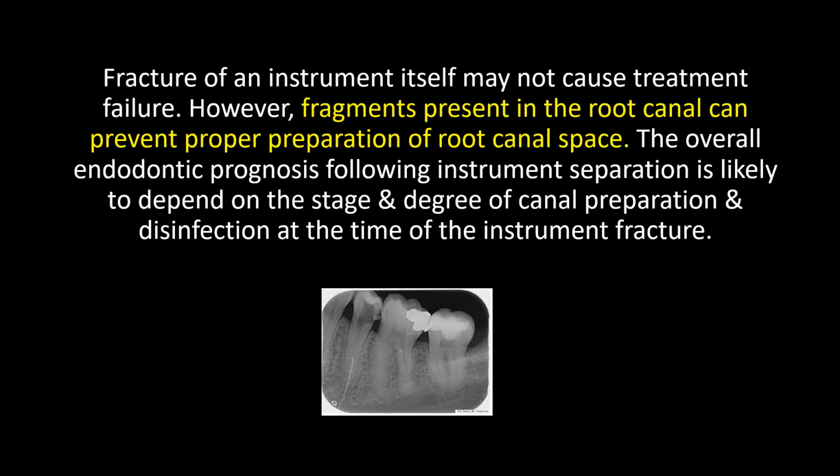Broken file retrieval, part 2. Fracture of an instrument itself may not cause treatment failure. However, fragments present in the root canal can prevent proper preparation of the root canal space. The overall endodontic prognosis following instrument separation is likely to depend on the stage and degree of canal preparation and disinfection at the time of the instrument fracture.